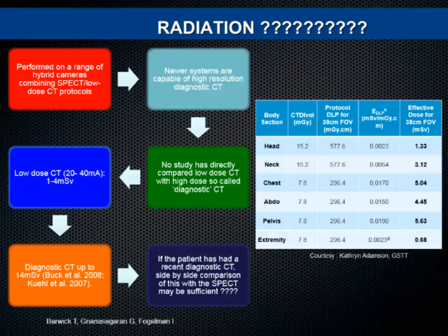Therefore, you can avoid more investigations, and you need to ask your radiologist also, with a brief, to say which is the best quality CT we can provide on this basis. And talk to an orthopod. That's the most important thing. So he will tell exactly what he wants from the SPECT CT. Because if you could satisfy the orthopod, everything, the perception will change of how you use SPECT CT.